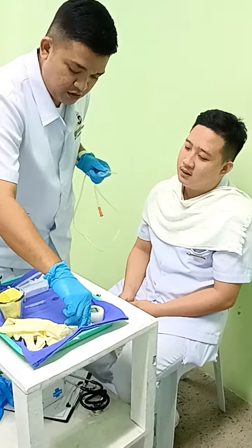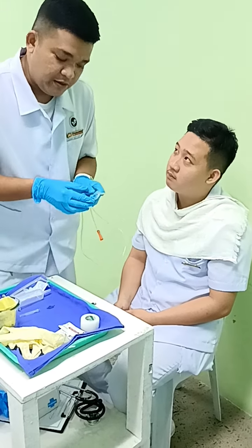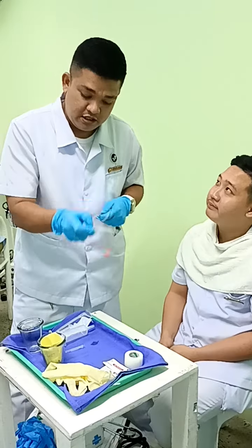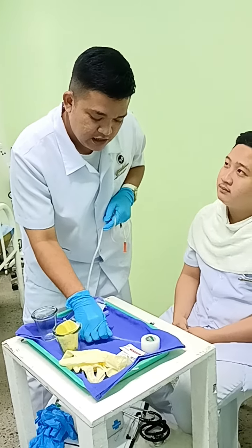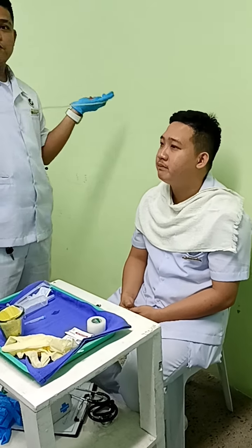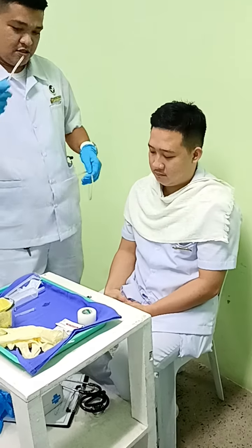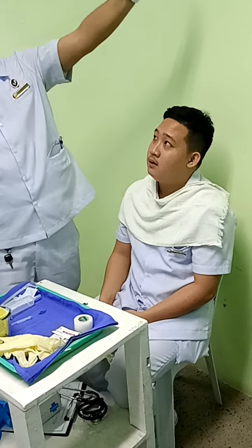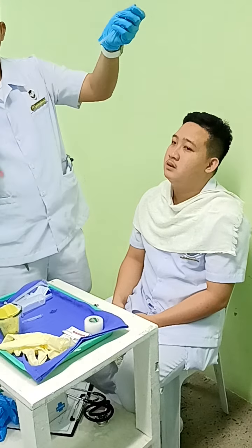We get a small amount of lubricant and roll the tube in it, approximately four inches. Then it's time to insert the tube at the patient's nostril. Sir, I will be coiling the tube so that it will not be moving sideways.